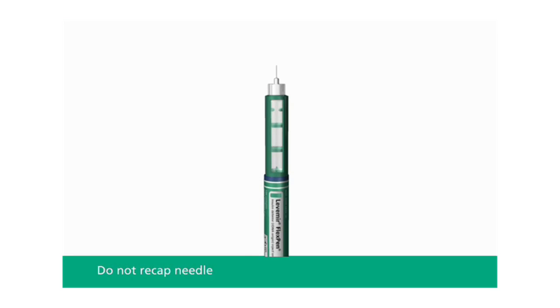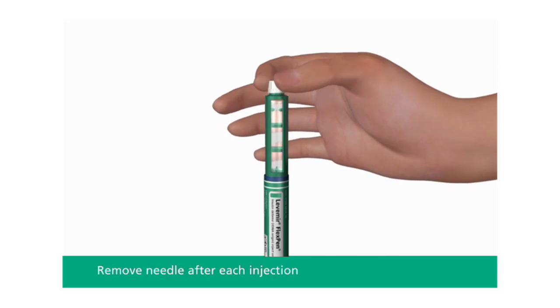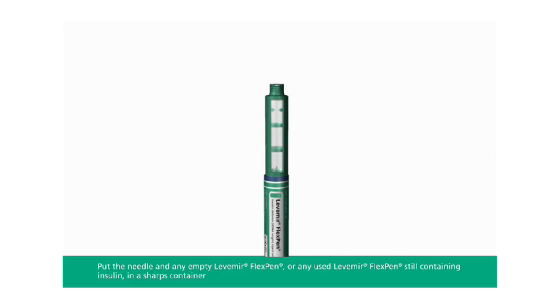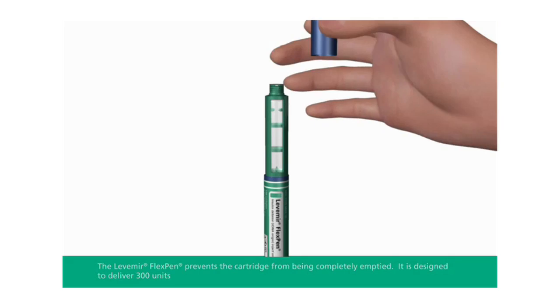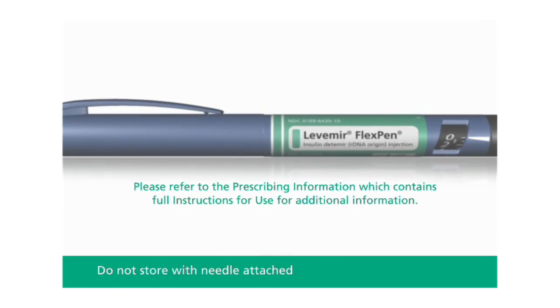Do not recap the needle — recapping can lead to a needle stick injury. Remove the needle from the Levemir FlexPen after each injection and throw it away as instructed by your health care provider. This helps to prevent infection and leakage of insulin and will help to make sure you inject the right dose of insulin. Put the pen cap on the Levemir FlexPen and store without the needle attached.